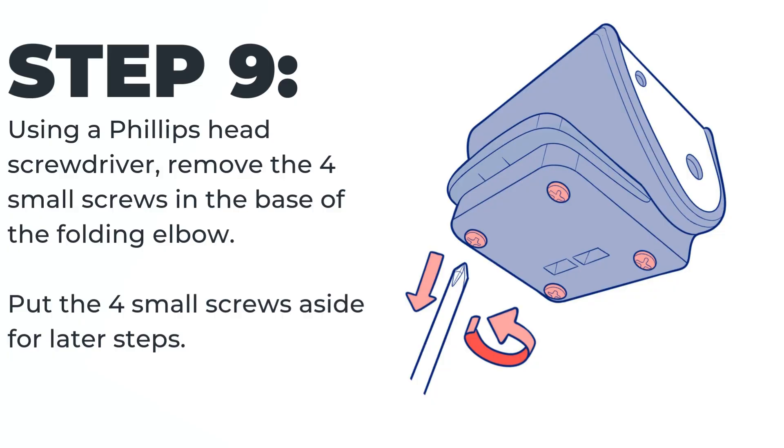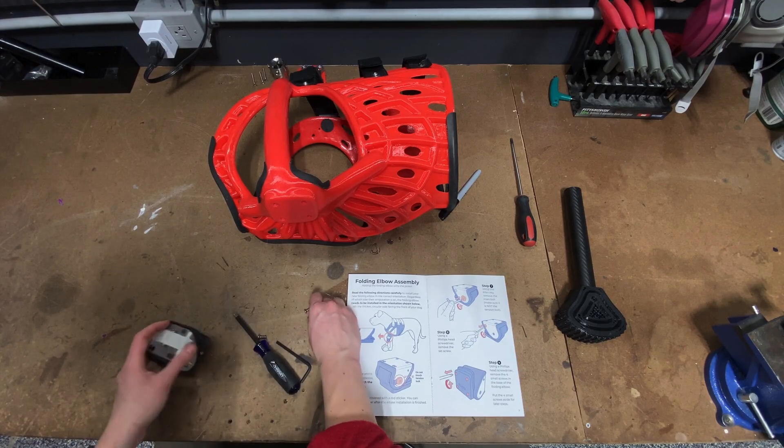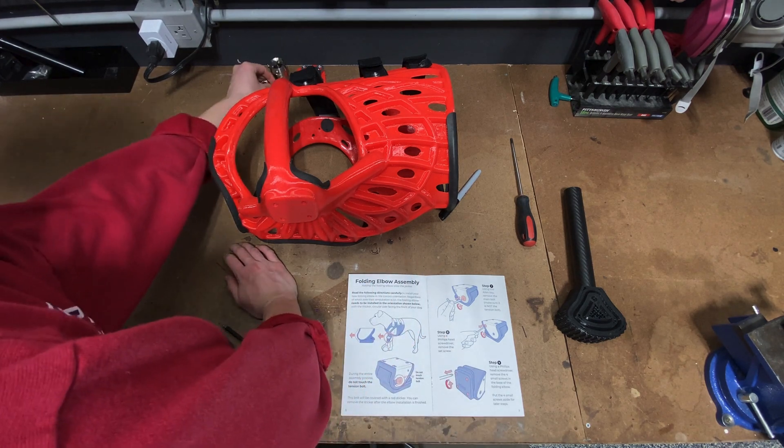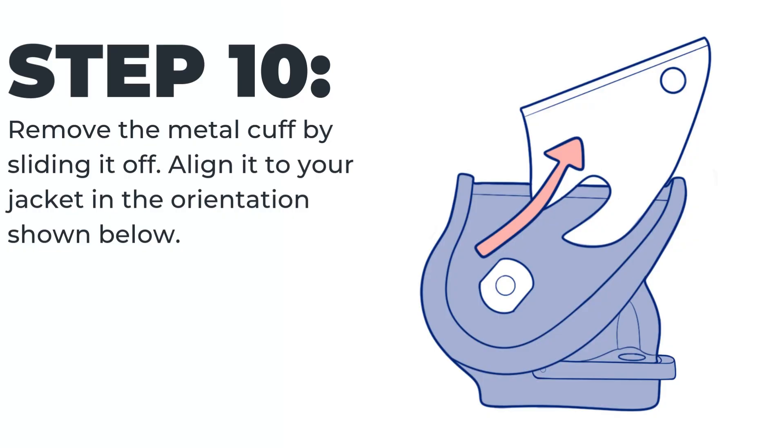Step nine: using a Phillips head screwdriver, remove the four small screws. Put these four small screws aside for later steps. Step ten: remove the metal cuff by sliding it off. The cuff will slide off behind the tension bolt, so you don't need to remove it.